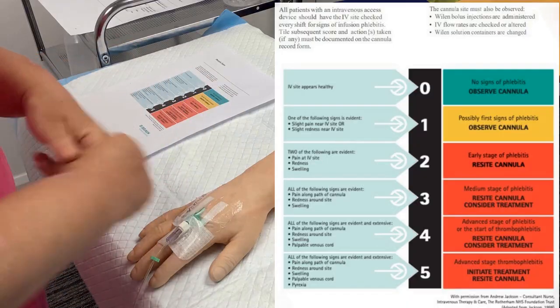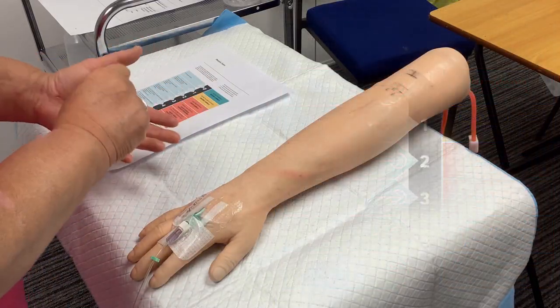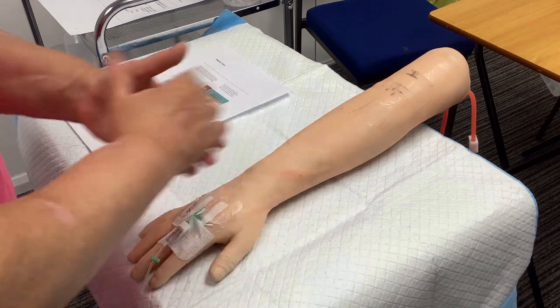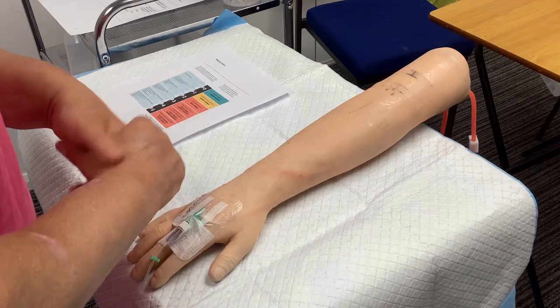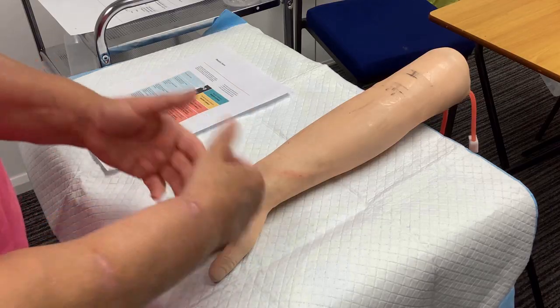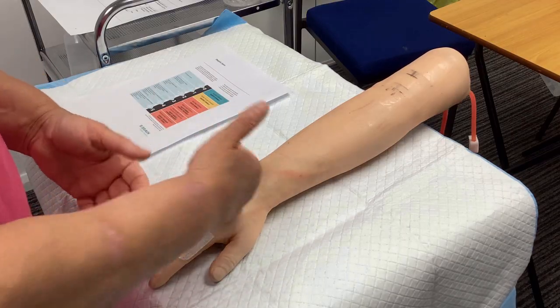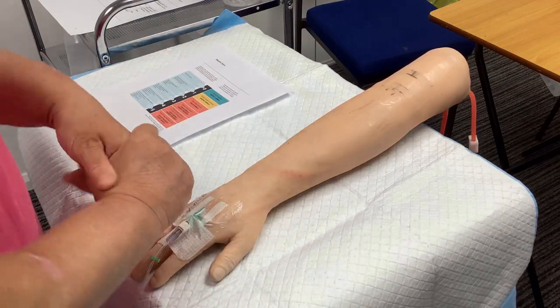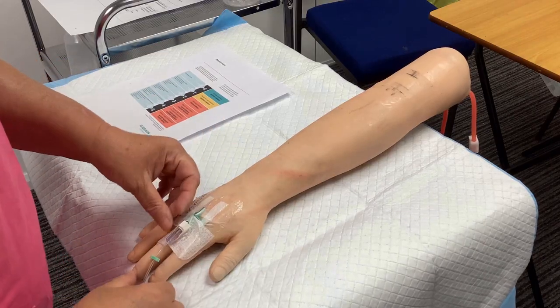If there was one aspect, say pain or redness, then I could still use it as that's a score of one. However, if it had both of those, then you would class that as a stage two, and I would not use it. So I can go ahead and happily use this cannula to do your IV flush.